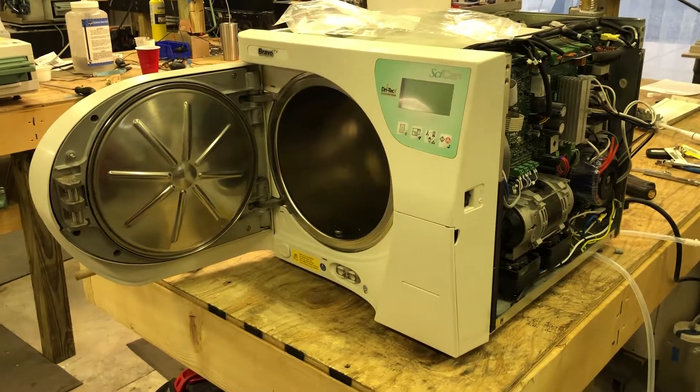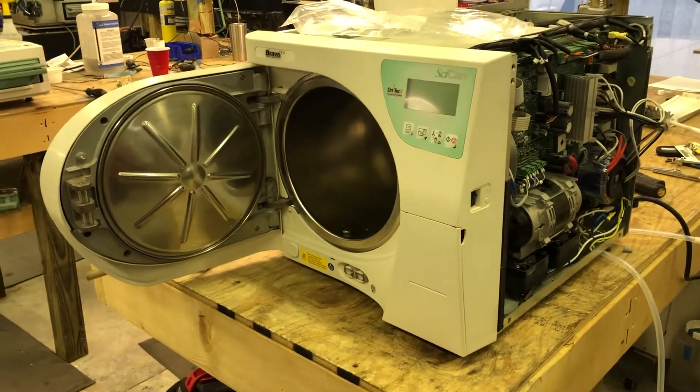Sterilizer autoclave solution. statumusa.com. 704-966-1650.